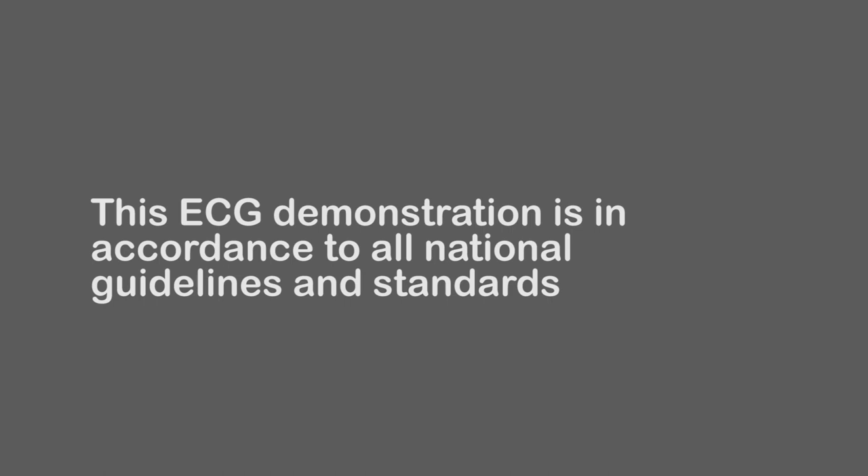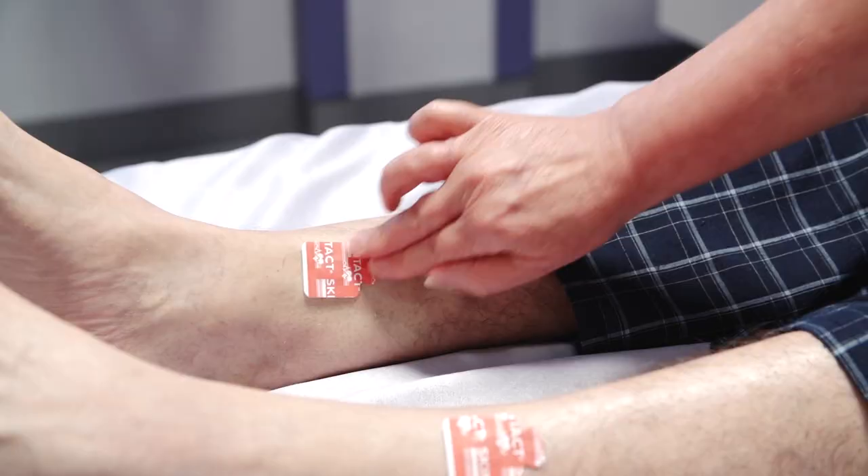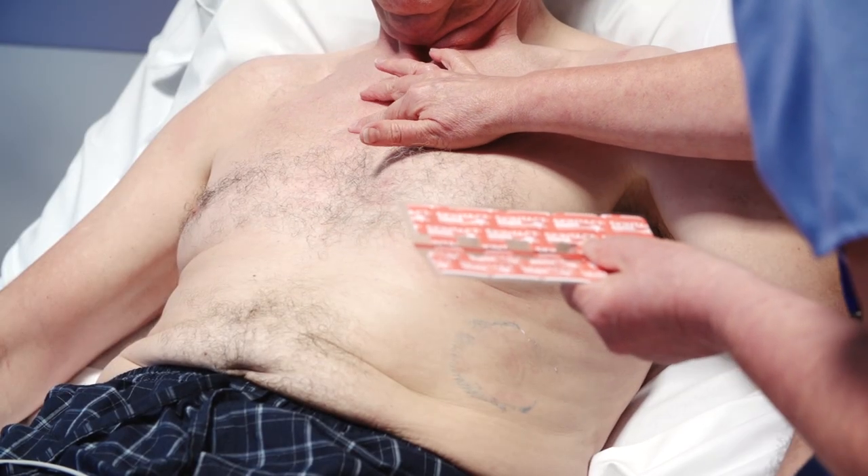The ECG you are about to see demonstrated is in accordance with all national guidelines and standards. Limb leads are placed both on the ankle and the wrist. Precordial chest positions are very specific.